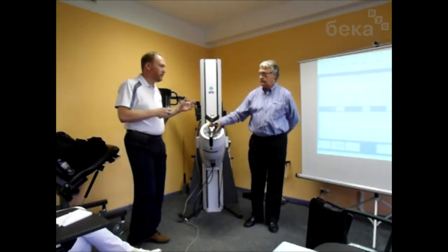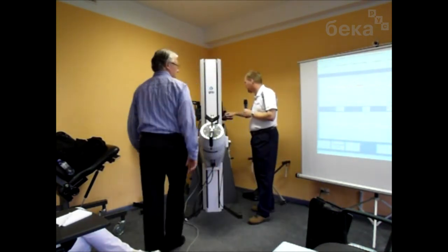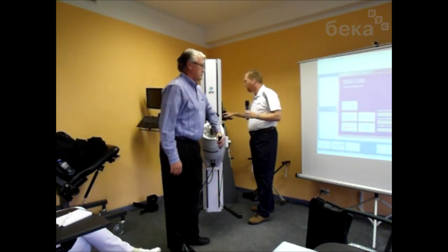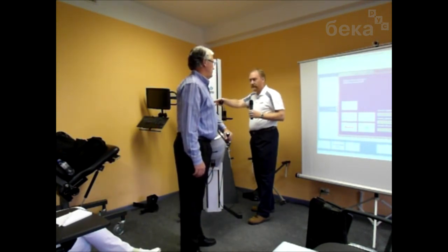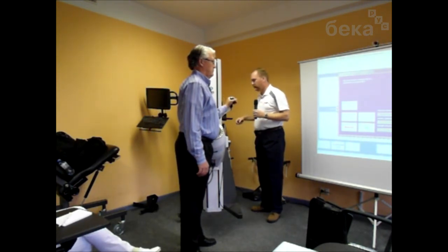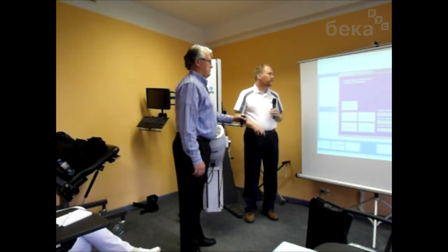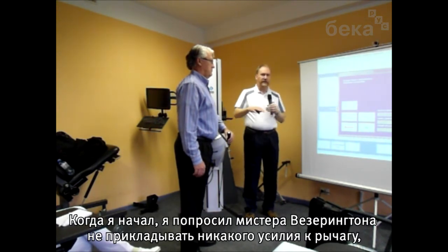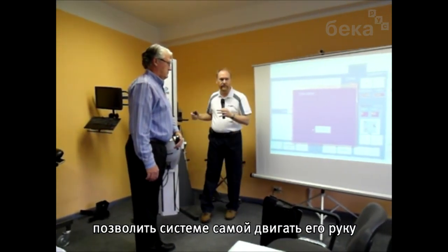Good. Okay. I'm just going to restart it again so we can get the machine moving. When I start, I'll just ask Mr. Weatherington to not exert any force on the handle, just to let the machine move him.